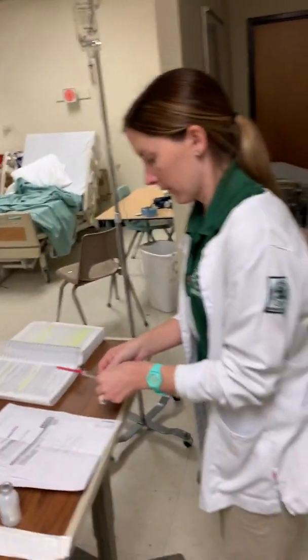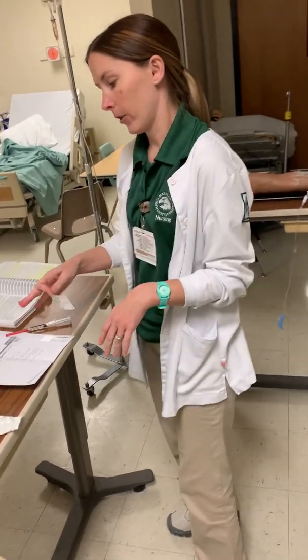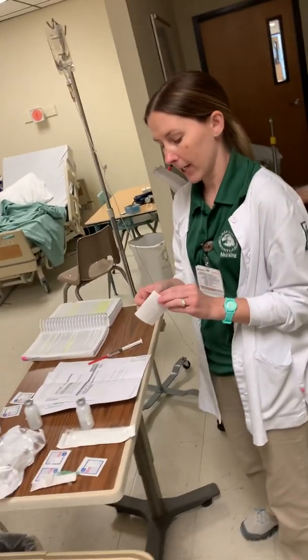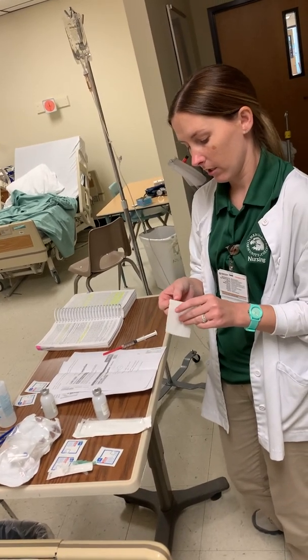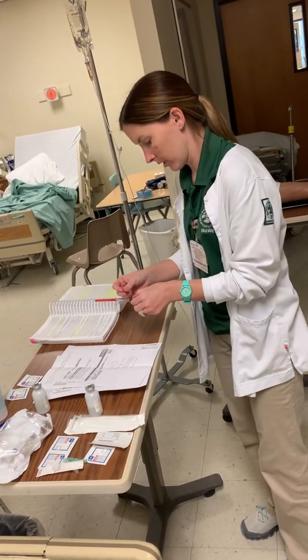All right, and the next thing I would want to do is put my label on, and on my label I want to make sure to put my patient's initials. I want to put the dose, so I want to put digoxin 0.2 milligrams, the date and time that I prepared the medication, and then I want to put my initials because I'm the one who prepared it. So I would take off my label. I'm going to attach it to my syringe.